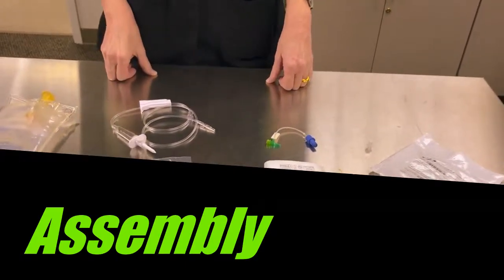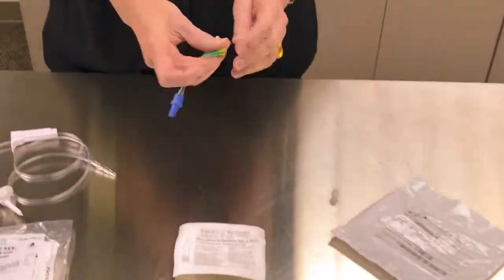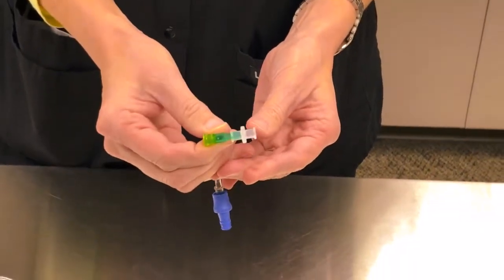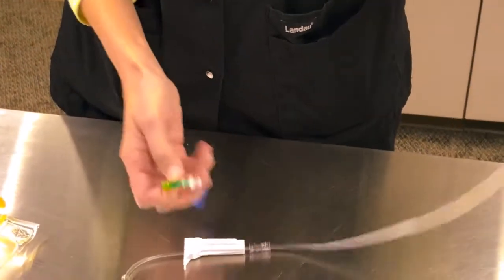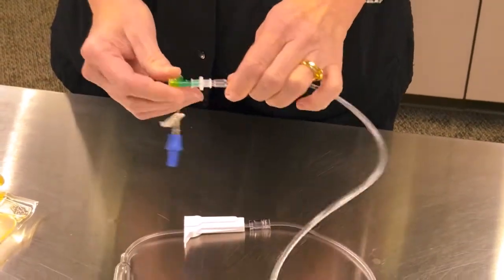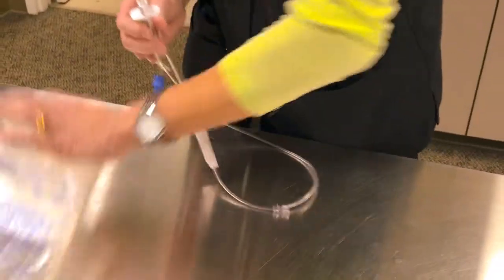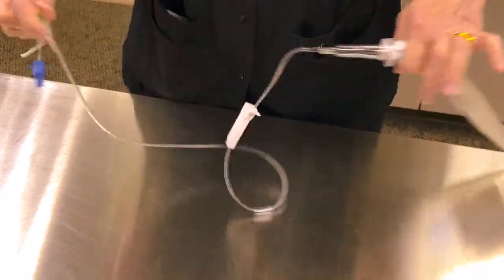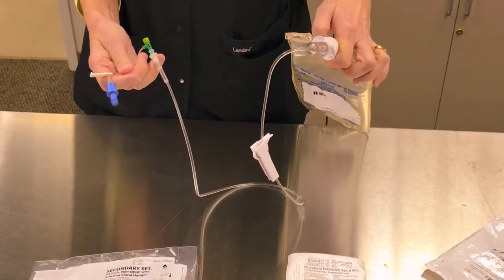Assembly of the simulated IV bypass system is quick and easy. You just take your IV extension set and connect it to one side of the adapter. It doesn't matter which one. Come over to your IV tubing, which is open. Connect it to the other side. Take the IV tubing and spike the IV collection bag, and you're really ready to go to the bedside at this point.